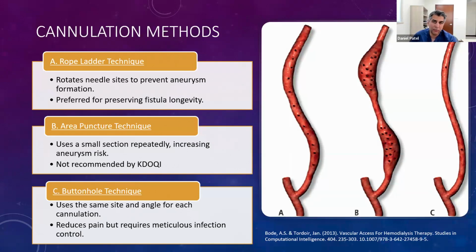We do encourage it still for home dialysis patients or patients that self-cannulate, where you always have the same person cannulating the access, but it's a little bit more of a challenge in a setting when you have different people cannulating the access. And we've seen more problems with that in center, but out of the center, it's been a little bit better because it's usually the same consistent person cannulating.